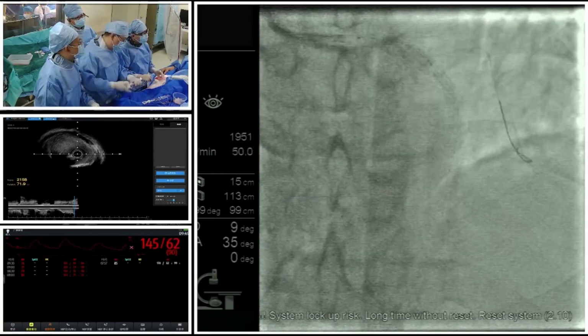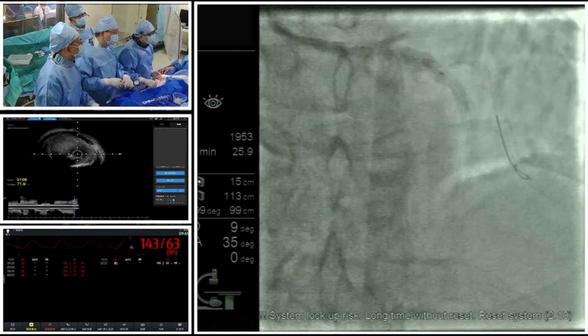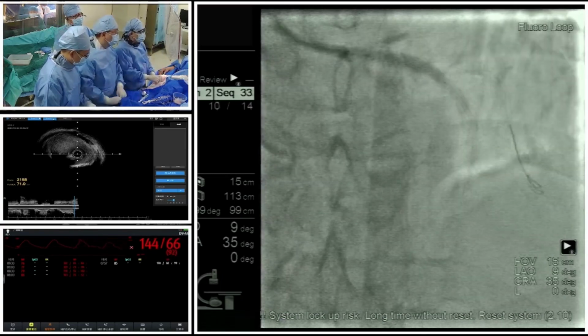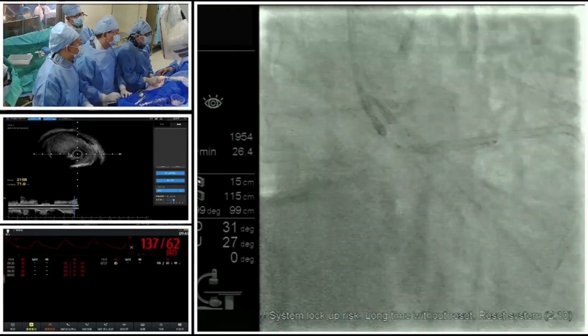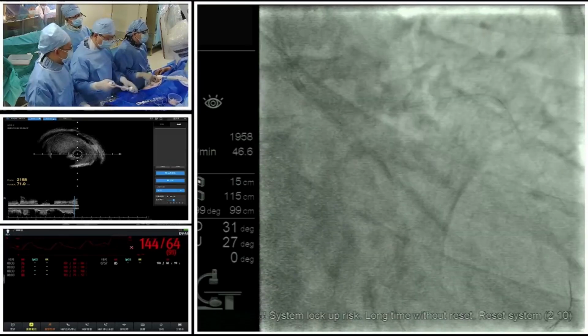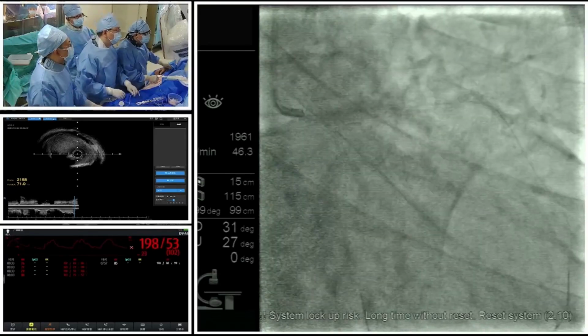just like in the previous case, Dr. Cao Yang communicated with us the difference between the rota and the IVL. As we all know, IVL is a new weapon for us, so there's less article in IVL compared with the rota.